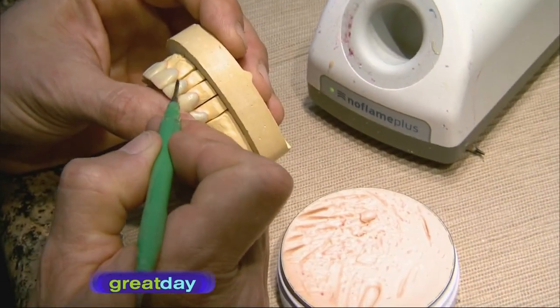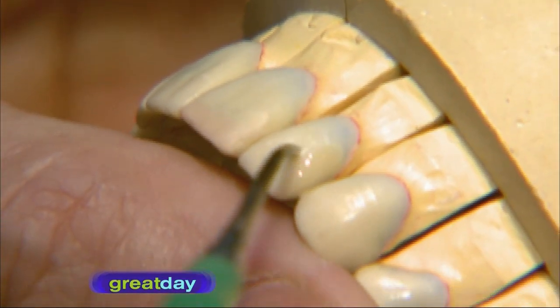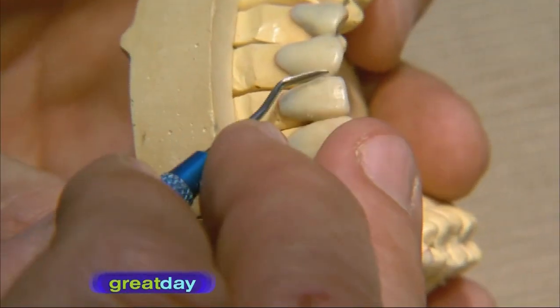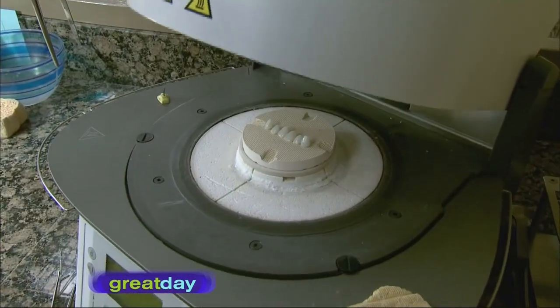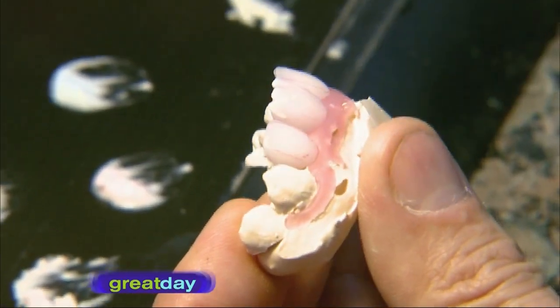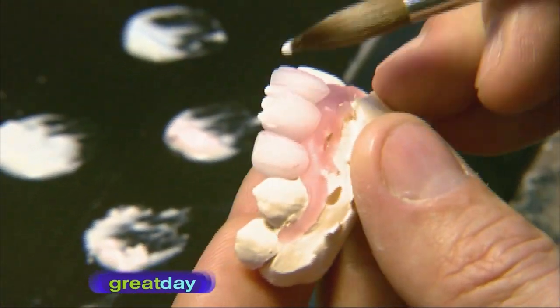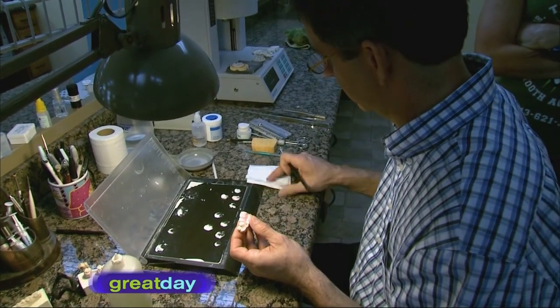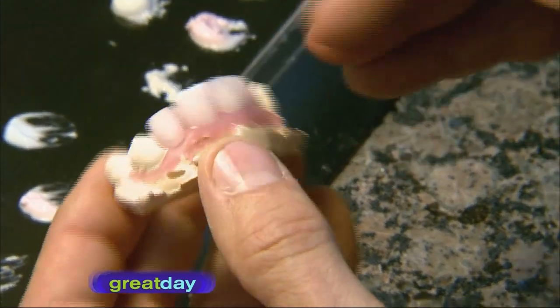This next step is difficult and requires lots of skill. Wax is added to the die to make it look like a real tooth. A machine then presses it and replaces the wax with porcelain. Layers of porcelain are built up — this takes time and a trained technician who must have a great eye for color. The technician will use photos to select the right shades of porcelain and build up the layers correctly to give the same appearance as the patient's adjacent teeth.